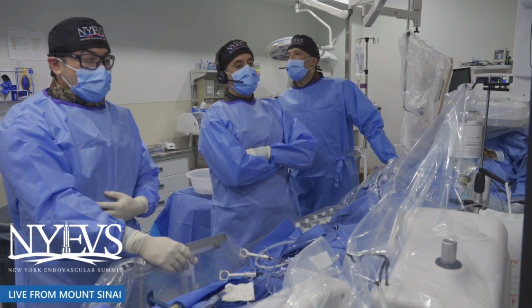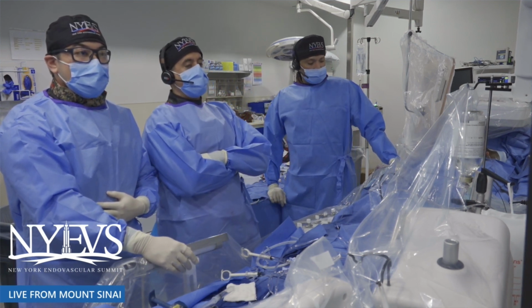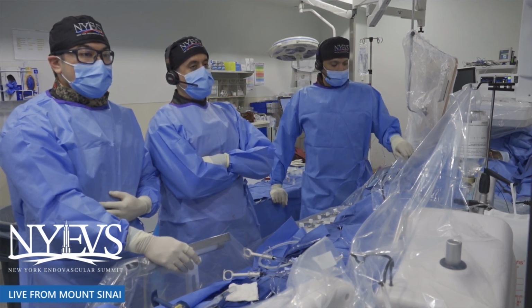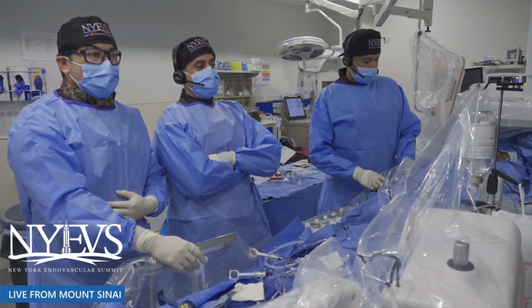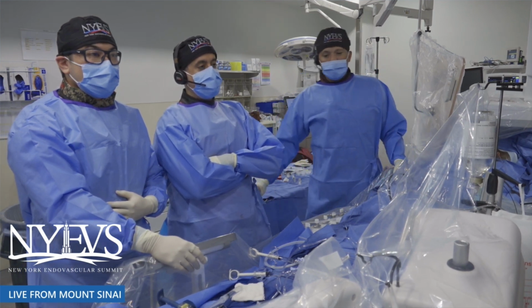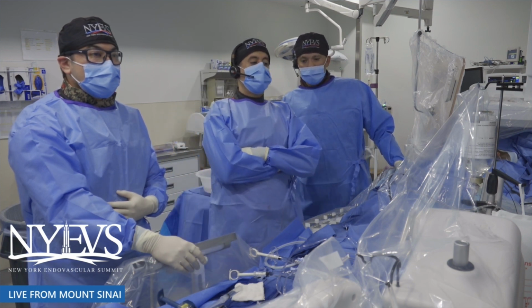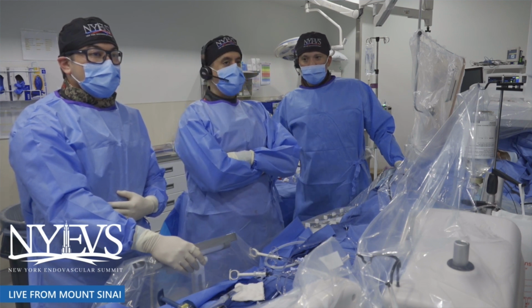Yeah, I mean, obviously IVL is more effective when you have concentric calcification. Eccentric, it's less so. And if we're talking about reducing the risk of perforation, even though that's not necessarily been borne out yet in studies, you are going to be using presumably covered stents here. And if so, you could potentially get away without doing IVL in this case. And I think maybe the IVUS might help you decide that.